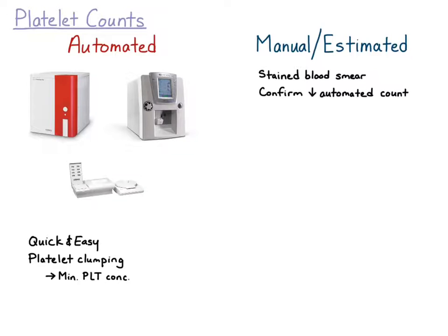And then secondly, making and evaluating a blood smear is much cheaper than running a sample through a hematology analyzer, so you may actually perform this if you're worried about cost for the client. And then finally, making a blood smear requires a lot less sample volume than running a sample through the hematology analyzer, so you might actually do this if you can't get enough sample to run it through the hematology analyzer.